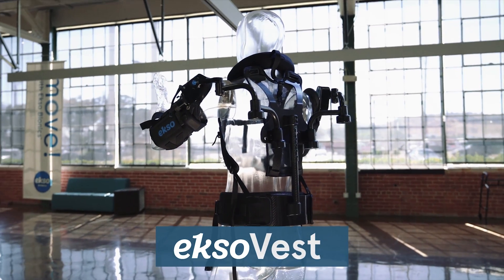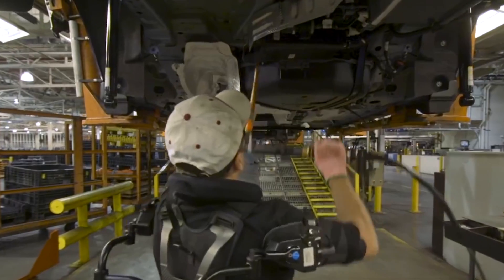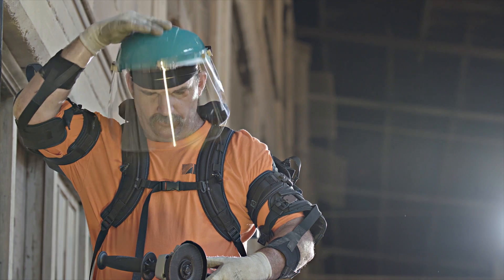We designed the ExoVest to deliver power without pain for professionals who work with their arms overhead. You put the vest on like a backpack, turn on the lift assist, and you're ready to go.